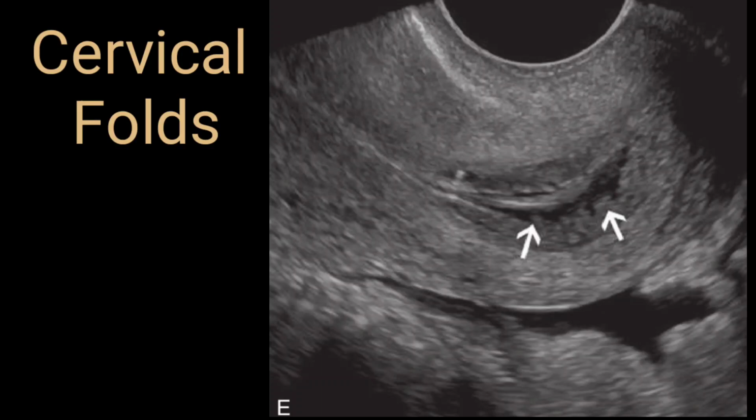On this transvaginal scan, you can appreciate cervix, and on the cervical area, these white arrows are indicating cervical folds. This is a very rare entity, although it is quite normal finding, and these cervical folds can be called plica palmata. But again, I would say that this is not a pathological process.